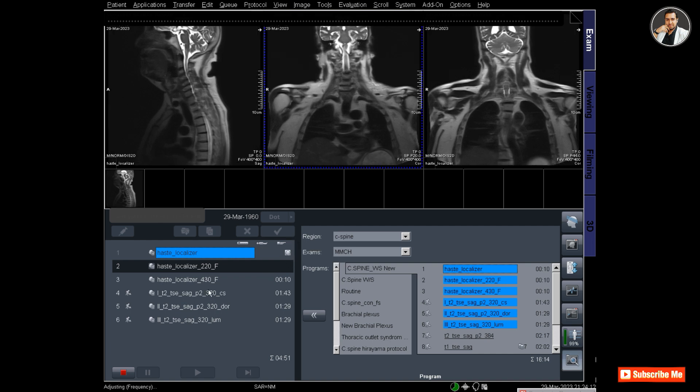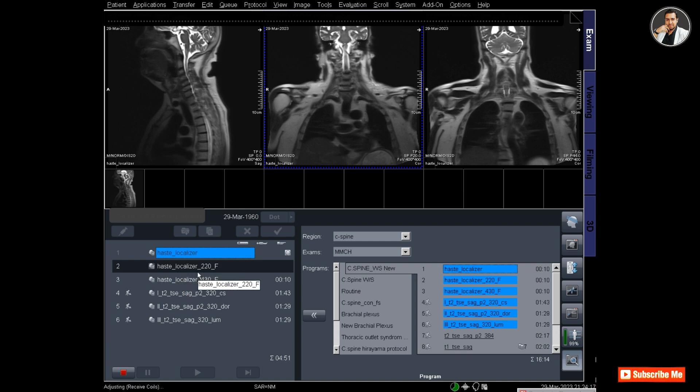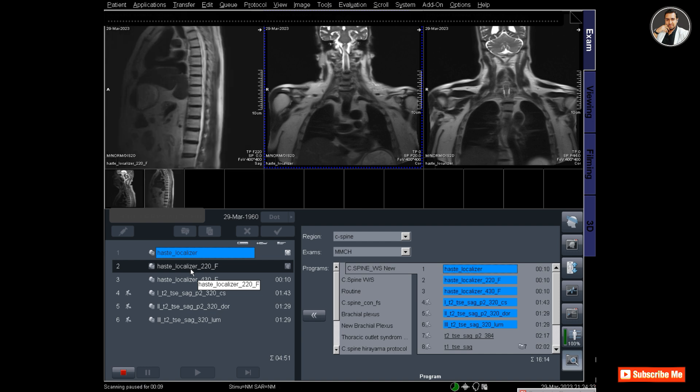Now the dorsal spine localizer is running. This Whole Spine software will make the composing automatically, but sometimes in older software it needs to compose the Whole Spine manually using the composing app.